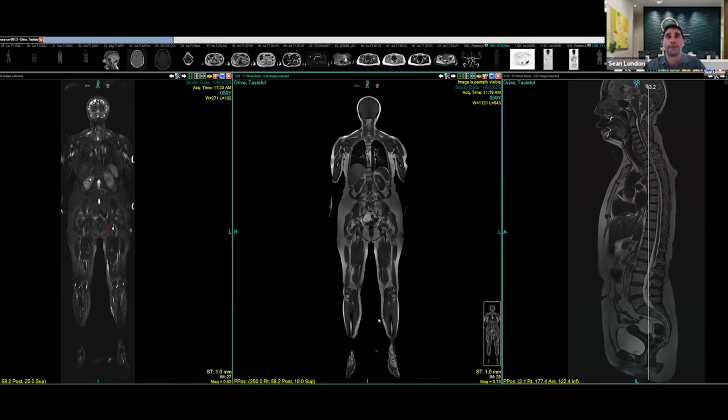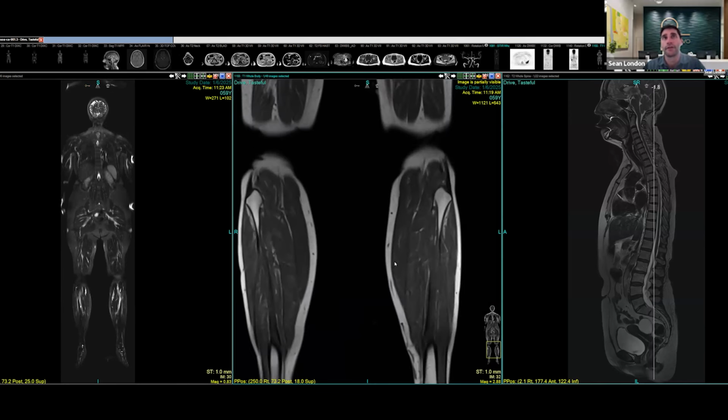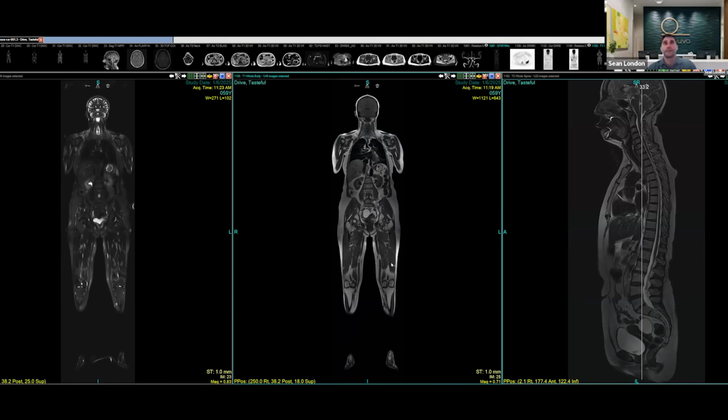I did notice these squiggly lines right here within the lower legs on the left. These are varicose veins. These are just dilated veins that people may notice even just on direct visualization. You'll see bulging veins on your skin, and that's what these are. So we can actually see those here. So that's a good example of a varicose vein. All right, I think that takes us to the end of the tour.